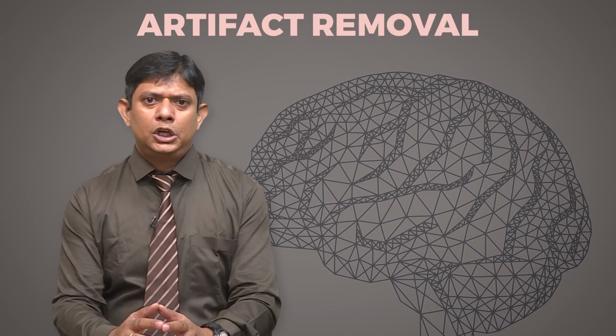The next factor is artifact removal. EEG recording can be affected by various artifacts such as muscle activity, eye movement and electrical interference. These artifacts need to be identified and removed to extract the true brain activity.